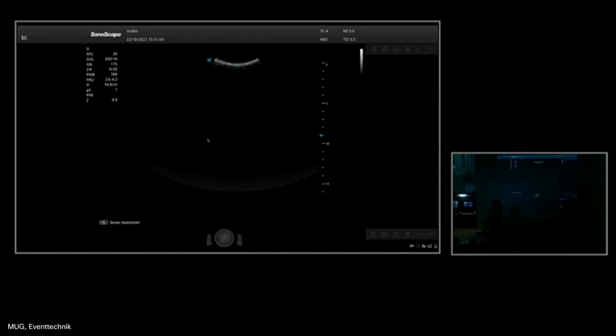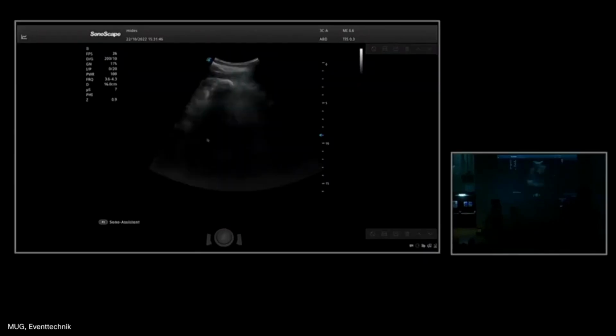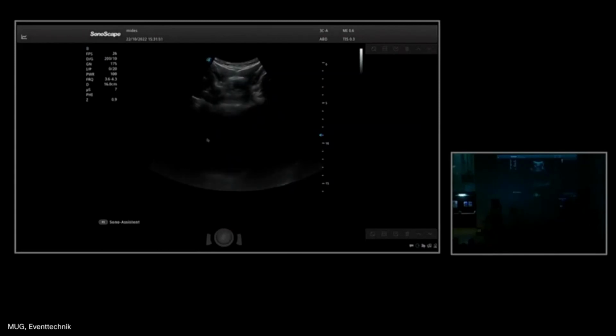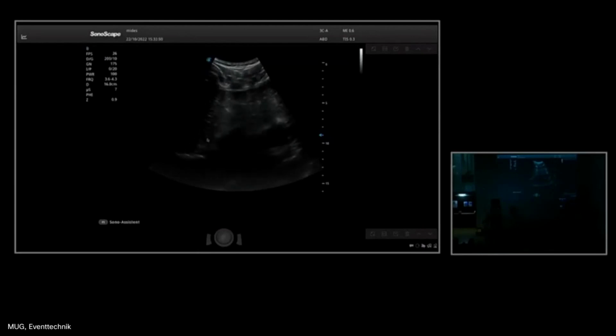I'm going to look at the pericardial pouch. Here sometimes we have more or less difficulties because, as I said, our patient is sometimes obese and we cannot push so much, or the patient has air in the transverse colon and the liver is not working like a window. So here, what do we see? I have subcutaneous tissue, I have a liver and a left lobe.